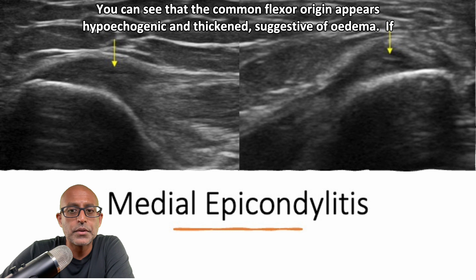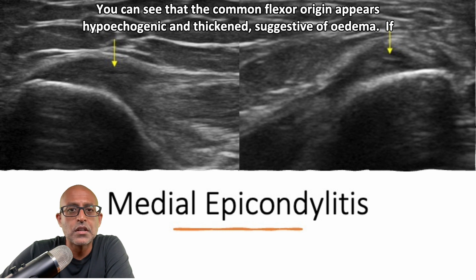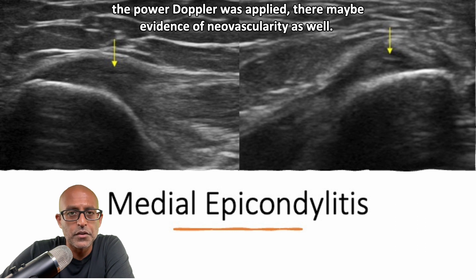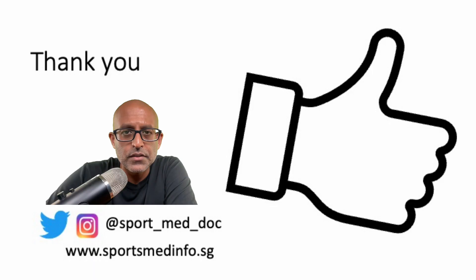Here are some examples of medial epicondylitis taken from ultrasoundcases.info. You can see that the common flexor origin appears hypoechogenic and thickened, suggestive of edema. And if power Doppler is applied, there may be evidence of neovascularity as well.